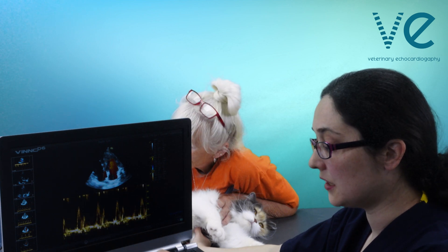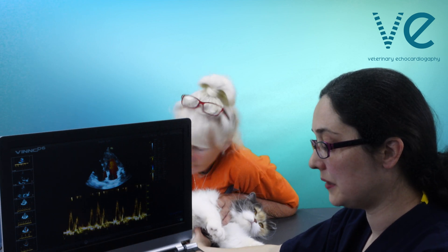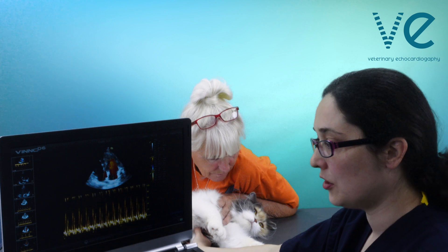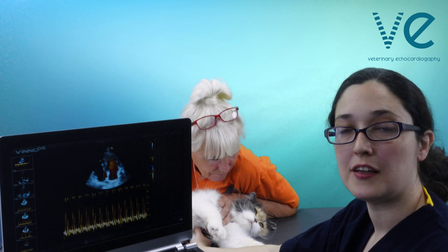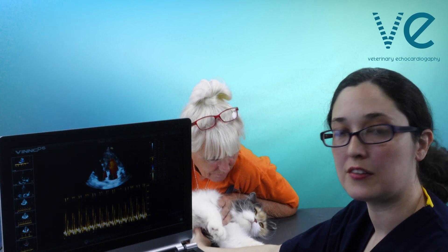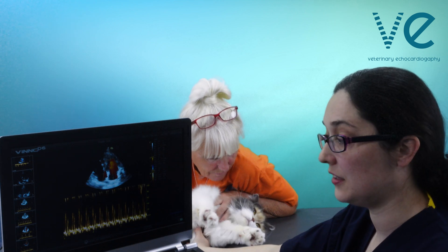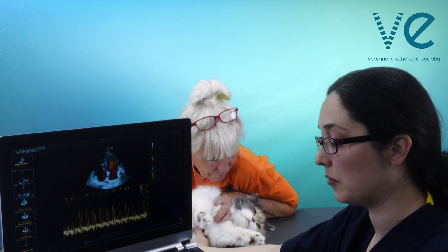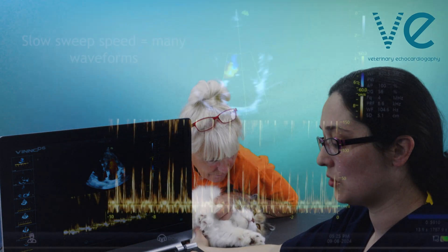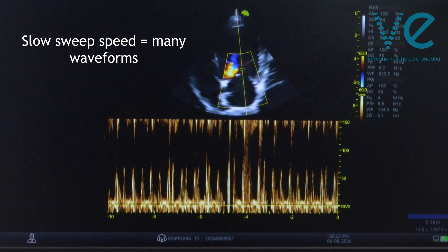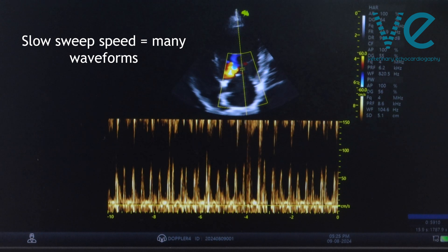By adjusting your sweep speed you can make it easier for yourself, so it may look like this when you first get your trace — that's very difficult to measure from — so make sure you increase that sweep speed.